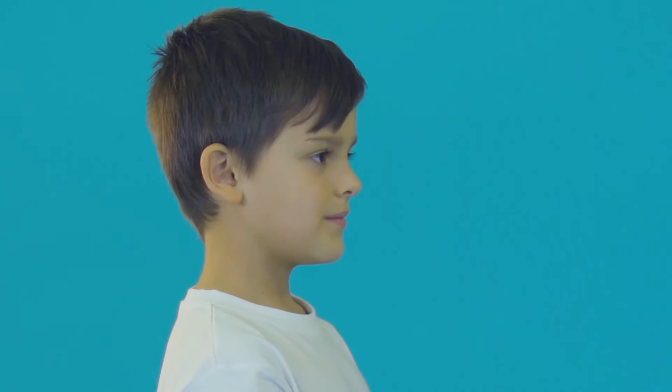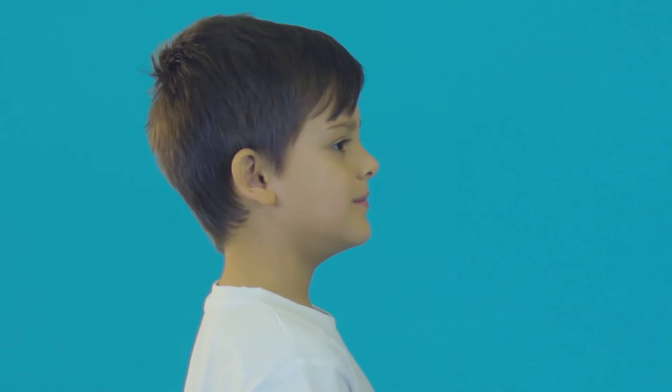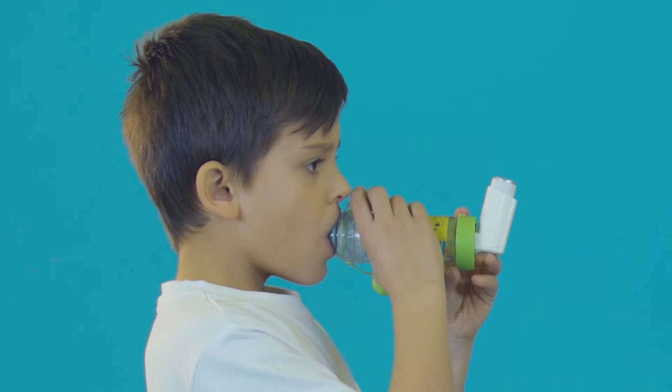If their healthcare professional has recommended single breath and hold technique, here's what they mean. Encourage your child to breathe out gently and slowly away from the inhaler and spacer until their lungs feel empty and they feel ready to breathe in. Ask them to put their lips around the mouthpiece of the spacer to make a tight seal. Press the canister on the inhaler once and have them breathe in slowly and steadily until their lungs feel full.